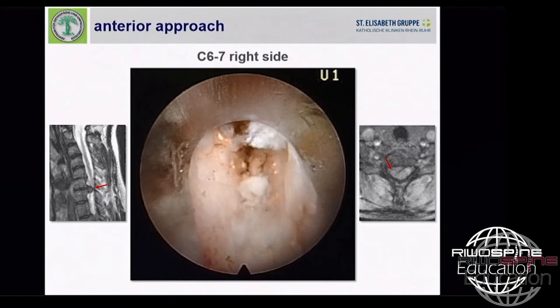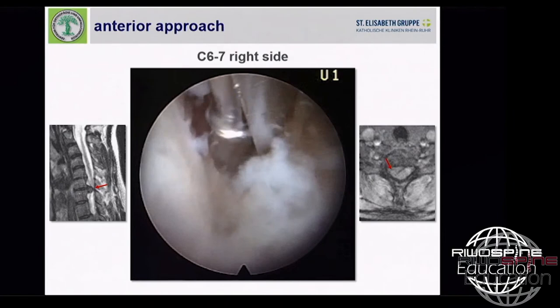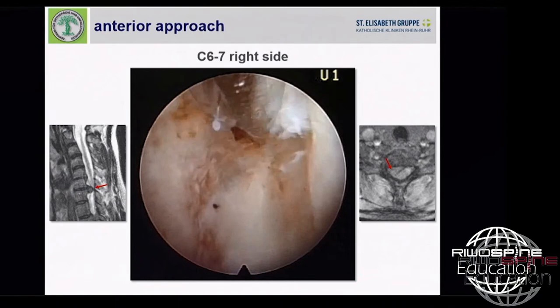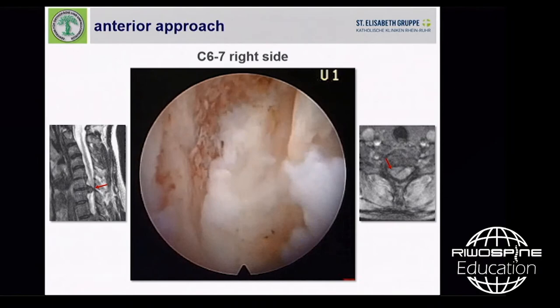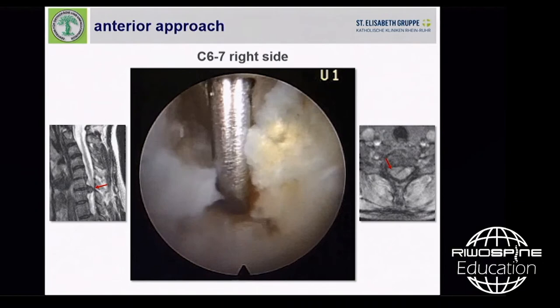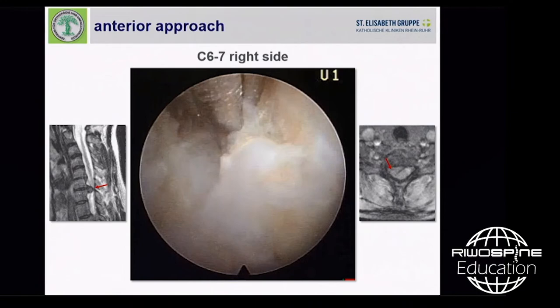That means that we are always working here in the posterior part of the intervertebral space due to the concavity of the vertebral bodies. You know that from open surgery. In most of the cases, it is necessary to get access to the spinal canal to resect bone here. Then we have, that is lateral here, here is medial, cranial and caudal. Then we have the posterior ligament, which is in front of us. And that's the defect here in the posterior ligament where the herniation went through.